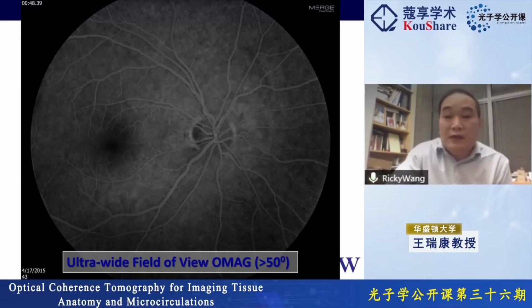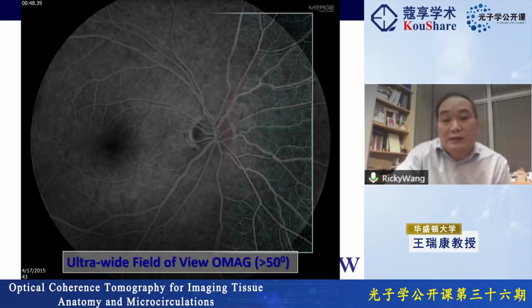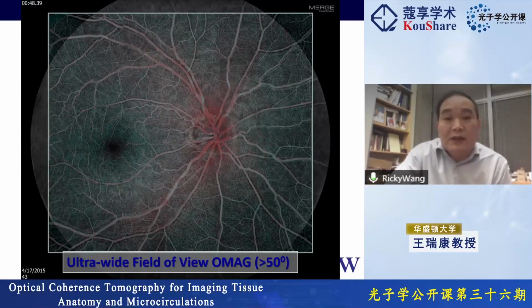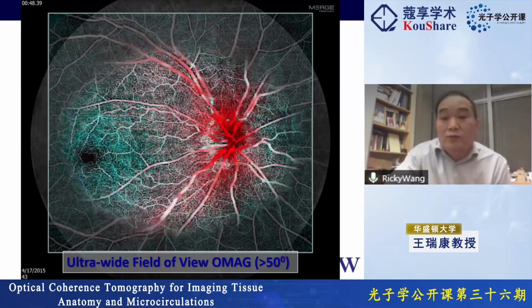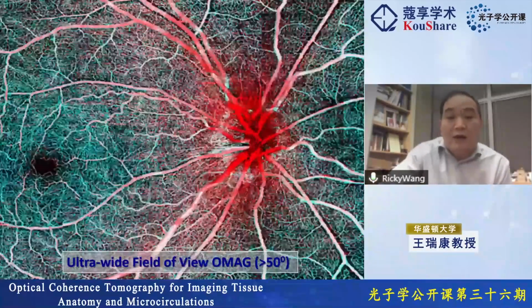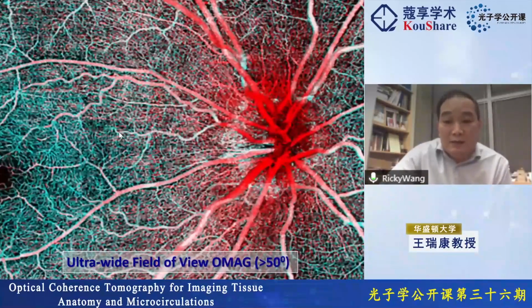Yeah, and if you turn on the OCT system to look at this subject or this patient, what you will see is this one. Okay, and because OCT has 10 microns resolution, you can see very clear, very detailed capillary blood vessels in the back of the eye. Because the resolution is 10 microns, you can zoom in, right? You can enlarge them to look in detail at how capillary blood flow is laid out in the retina.